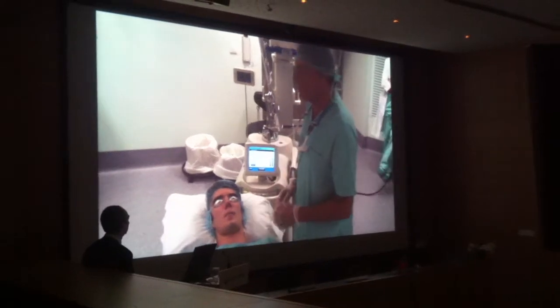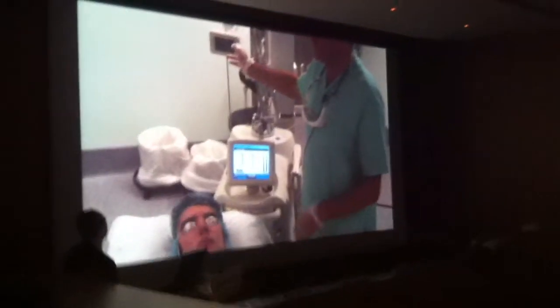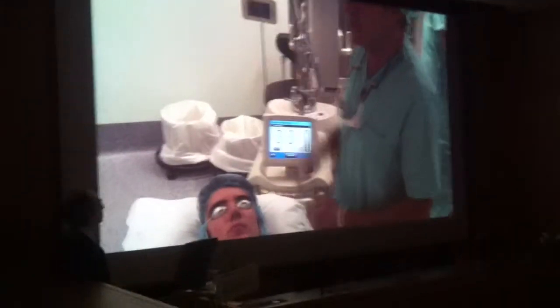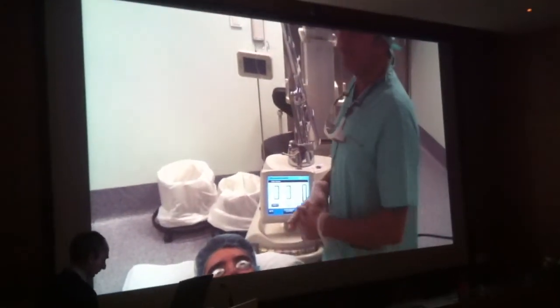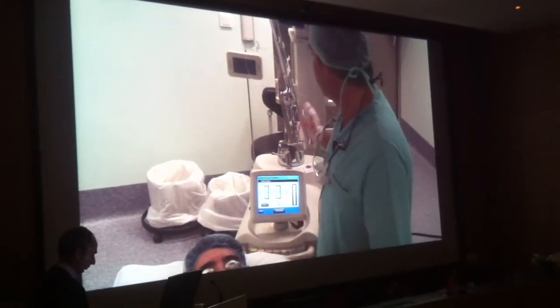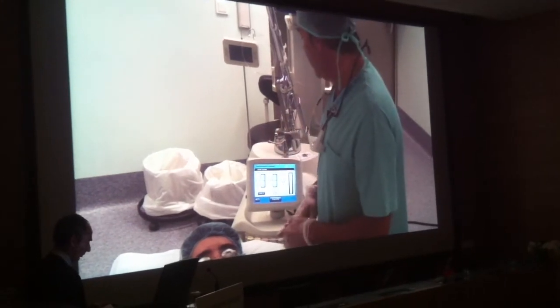Which we don't have time to talk about, but as a side note, the same Er:YAG source can be connected to a laser lipolysis system, and this arm can deliver different wavelengths from 1064 through 1320 and 2940, which is what I'm going to demonstrate to you.